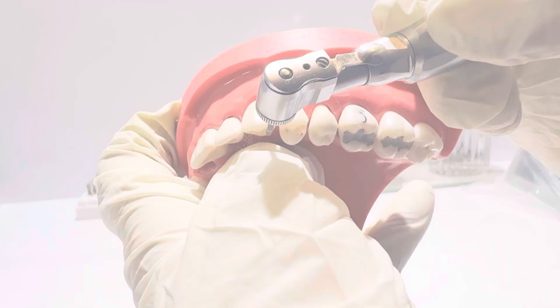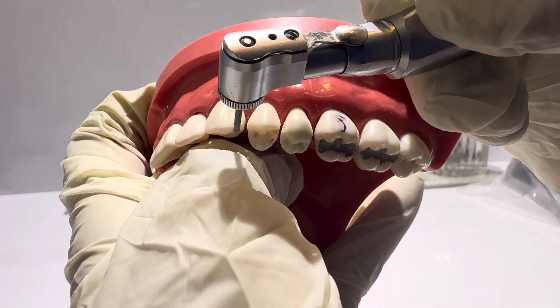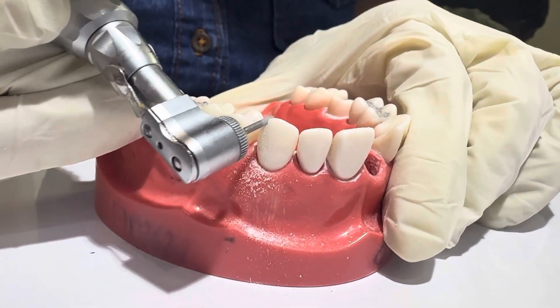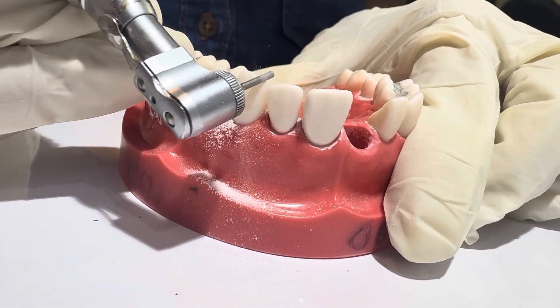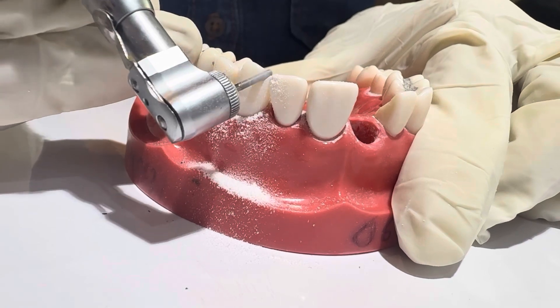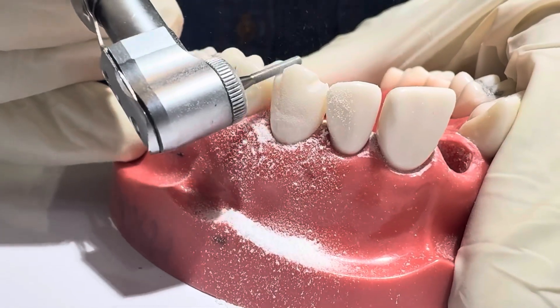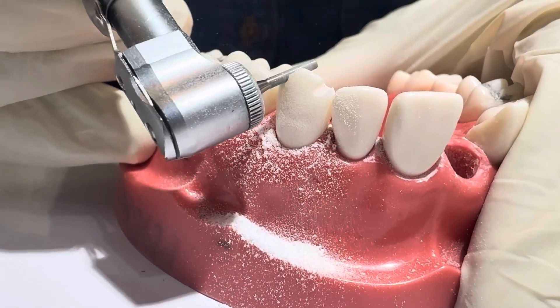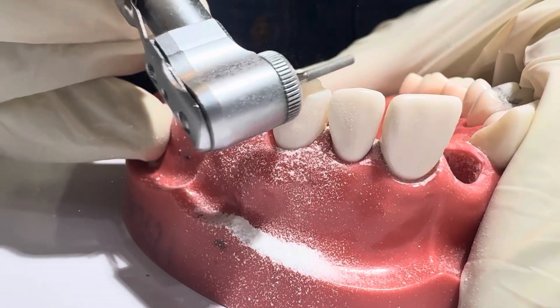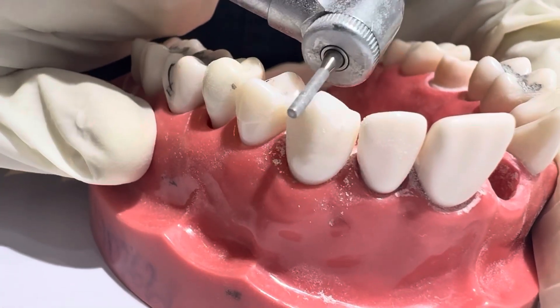Step 2: Incisal reduction. Place depth grooves across the incisal edge — one groove on mesial side and other on distal side. Reduce 1.5 to 2.0 millimetres to provide space for strength and aesthetics. Maintain the natural incisal morphology.